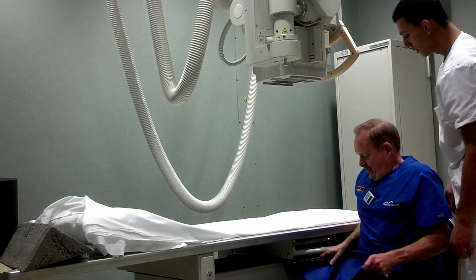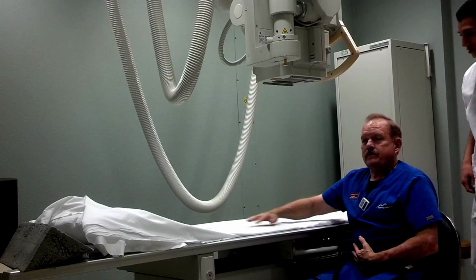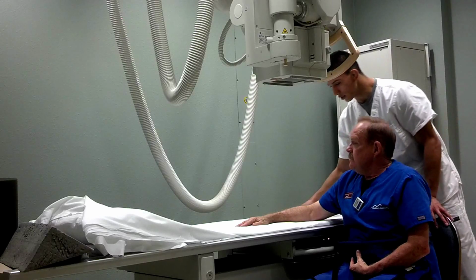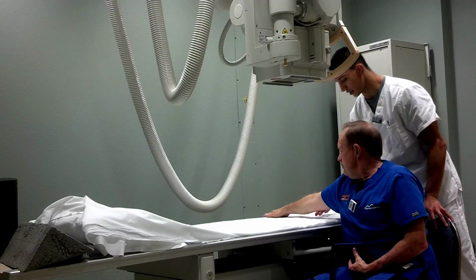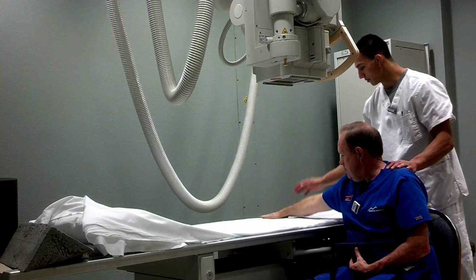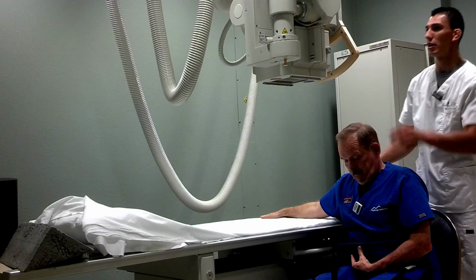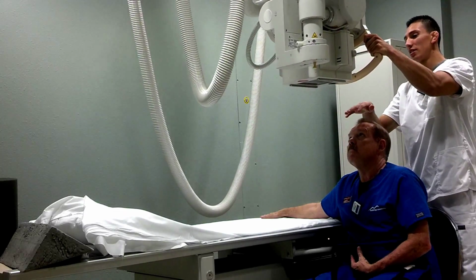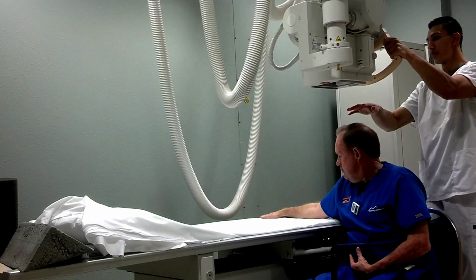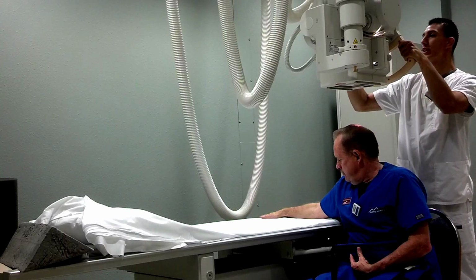Okay, and it's the right shoulder, correct? Yes. All right, so we're going to extend your arm about 90 degrees, so you're going to have it out that way. Yeah, just like that. And flat down, palm down as well. And I'm going to bring the tube over without hitting the patient's head. And I'm going to angle this one 15 degrees.